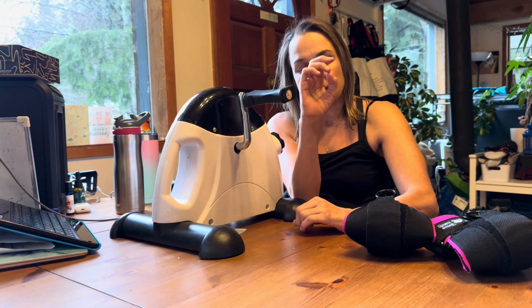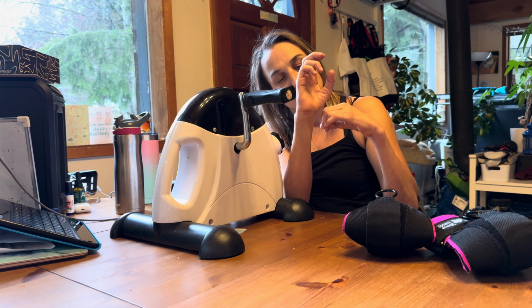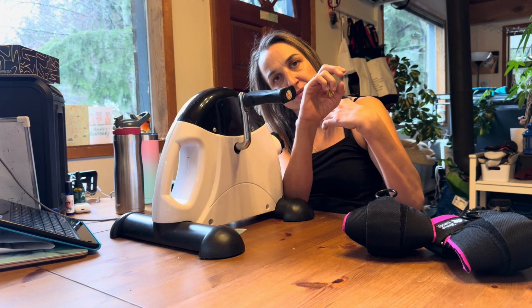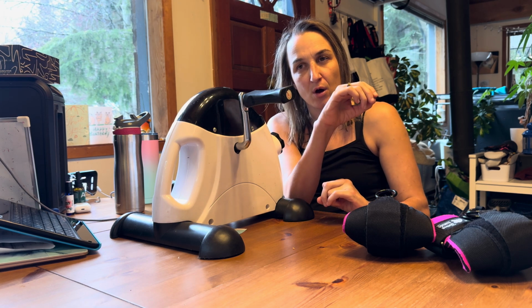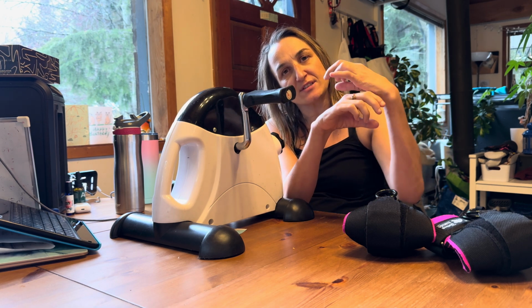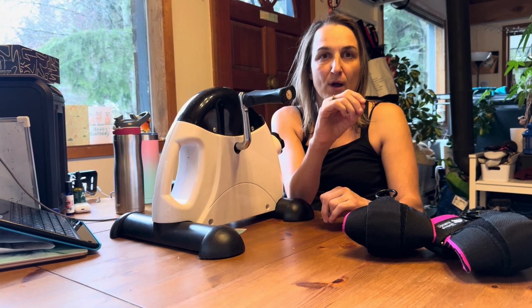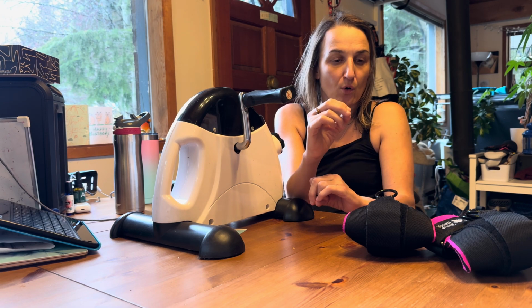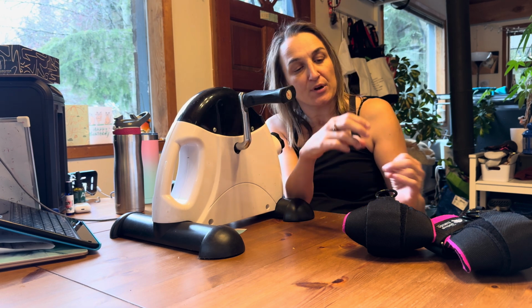And the reason behind that is that because there's weakness on this side of those muscles, so my hand ends up deviating towards where my thumb is. And then because of that, it comes out of the cup with the small active hands. So having it a size over will make the cup a little bit bigger, so that way your hand stays inside the cup rather than coming out, and then it's hard to grab certain things, and it's just harder to pedal or do weights or whatever you need to do with the active hands. So now putting those on.